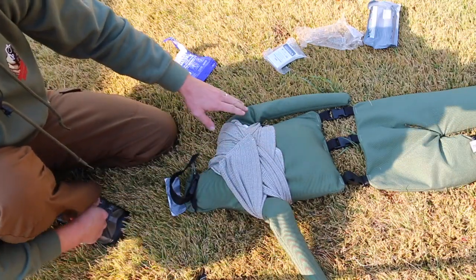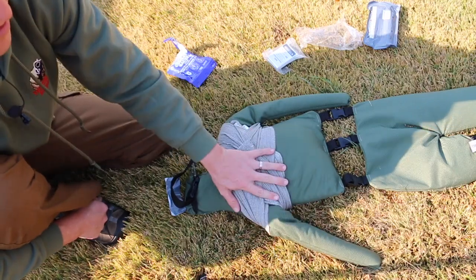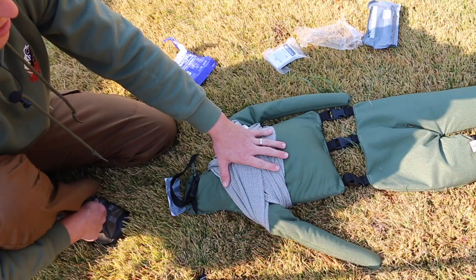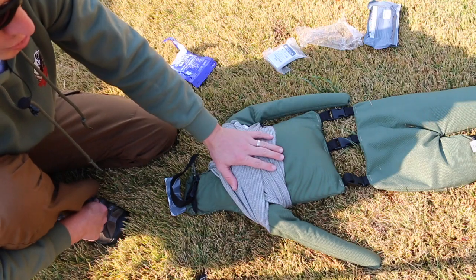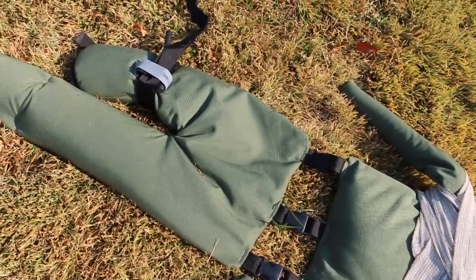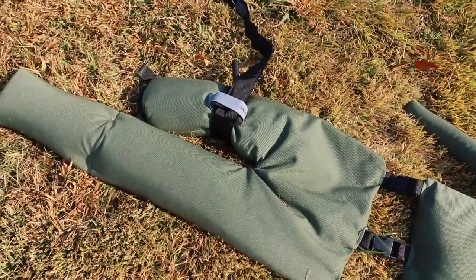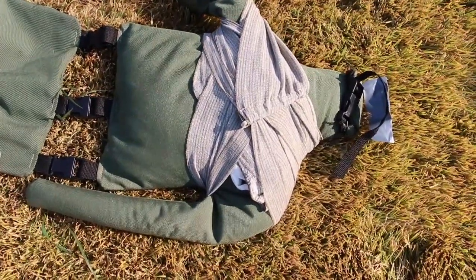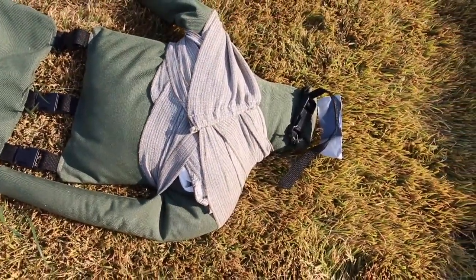Now, of course, you can use a pressure bandage on the extremities. If you see some bleeding, but it's not necessarily an arterial bleed, and you don't think it needs a tourniquet, you can use a pressure bandage, things like that. All right, so this is the M portion, the major hemorrhaging part of the MARCH algorithm. We've controlled major hemorrhage on the extremity and axillary here showing in the shoulder. So now we will move on to airway.